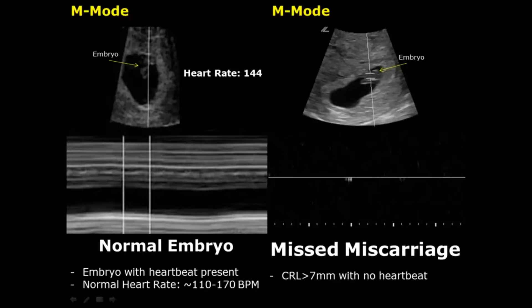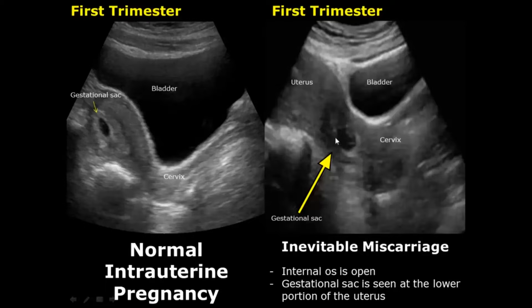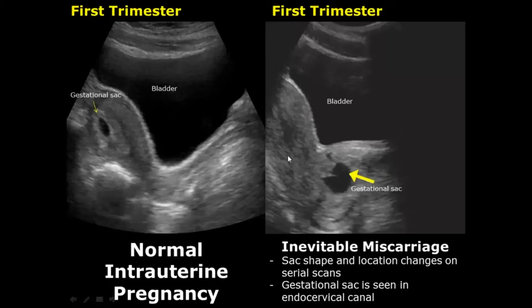We must wait and watch as it can recover on further scans. In an inevitable miscarriage, the internal os is open and the gestational sac is seen at the lower portion of the uterus. In this image, you can see a change in the shape and location of the gestational sac — on repeated scans, the gestational sac can be seen changing its position and moving downwards, also changing its shape.